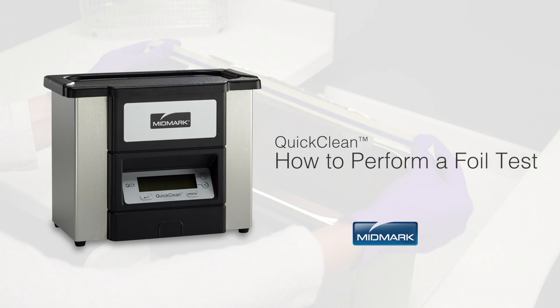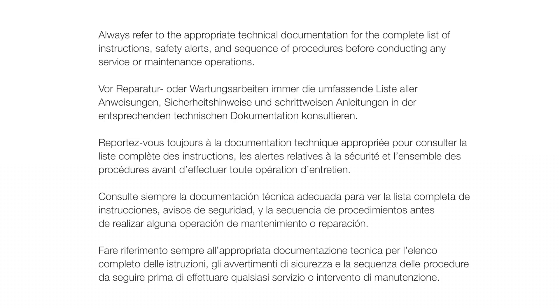This video is an overview of how to perform a foil test on your ultrasonic. However, always refer to the appropriate technical documentation for the complete list of instructions, safety alerts, and sequence of procedures before conducting any service or maintenance operations.